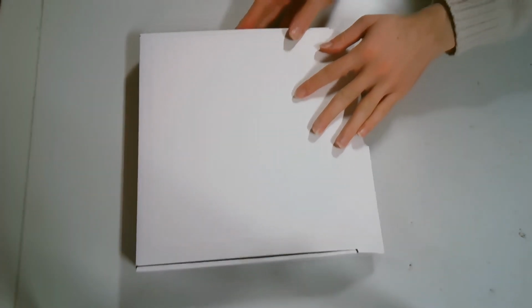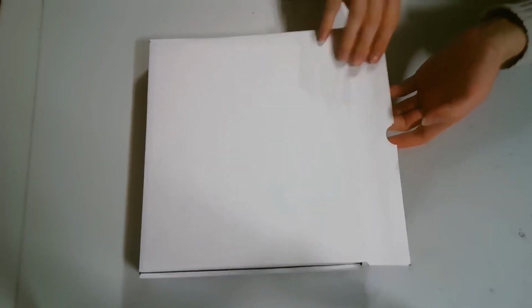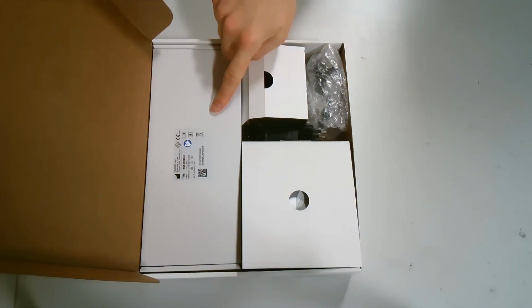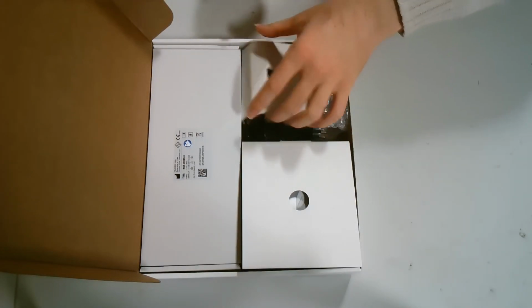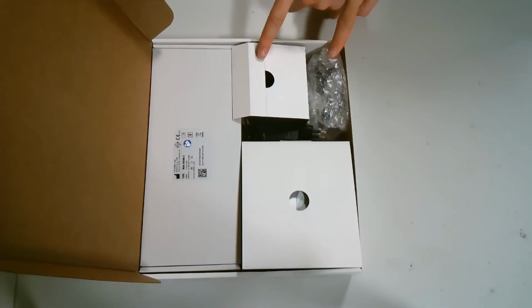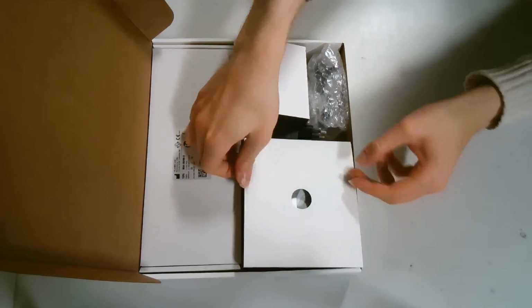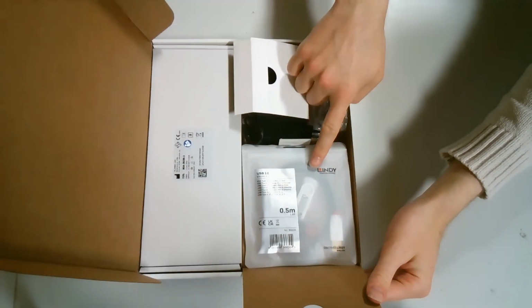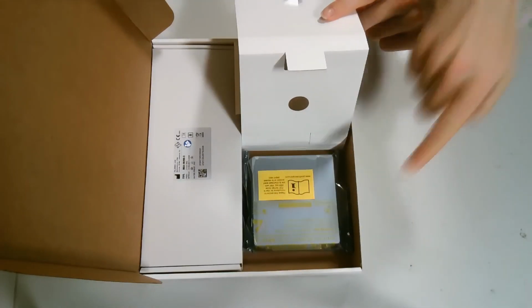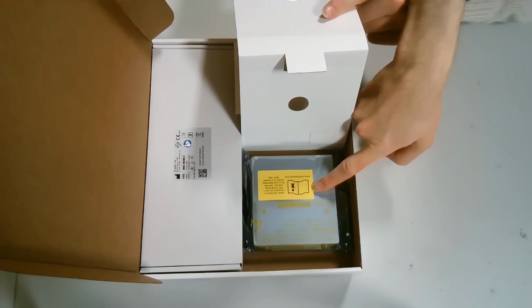Your ultrasound system contains the following items: the ultrasound probe, the electrical power adapter, a pouch containing 3 items, the ultrasound scanner.